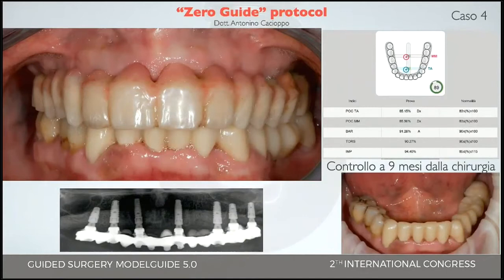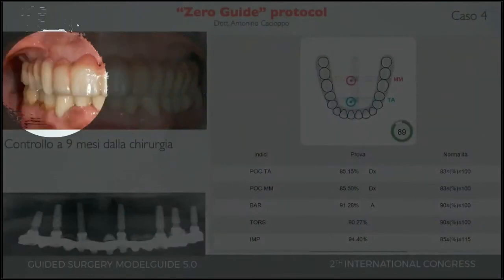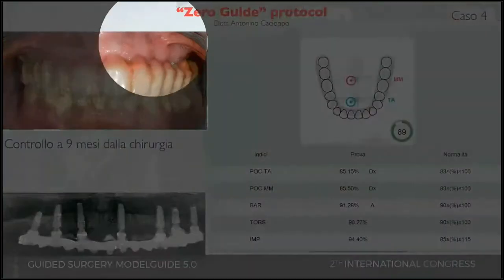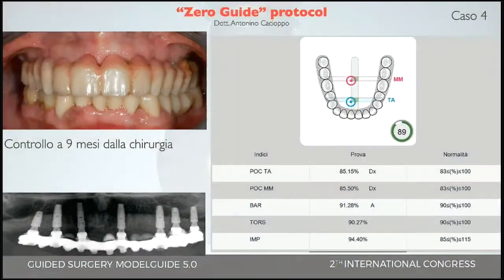Nine months after the surgery, and after managing the provisional for nine months, 100% guided by Teethan, this is the aspect of my balance. It's not related to aesthetics because this is a bad provisional. I don't care at all. I want pretty amazing gums at this point. I don't care absolutely about the aesthetics of the provisional at this time. Of course, later I will start.